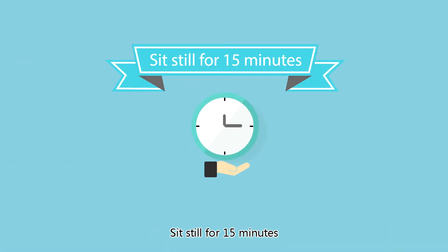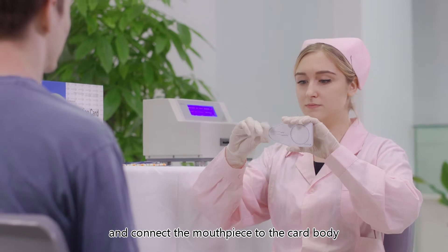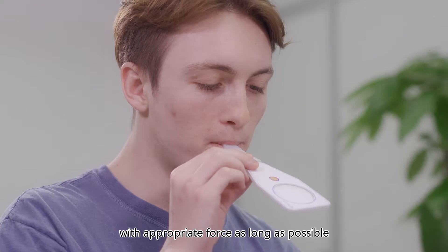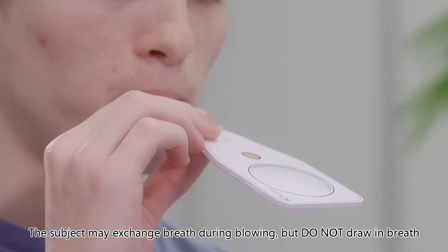Unpack the collection card and connect the mouthpiece to the card body. The subject should blow through the mouthpiece with appropriate force for as long as possible. The subject may exchange breath during blowing, but do not draw in breath.